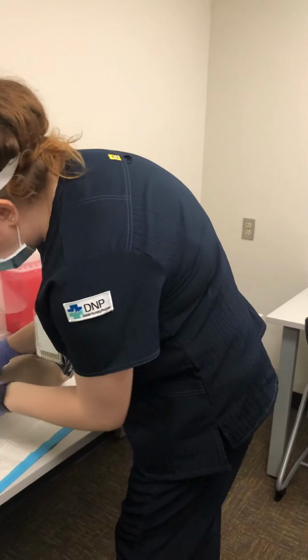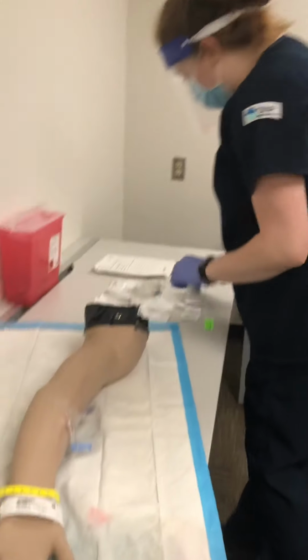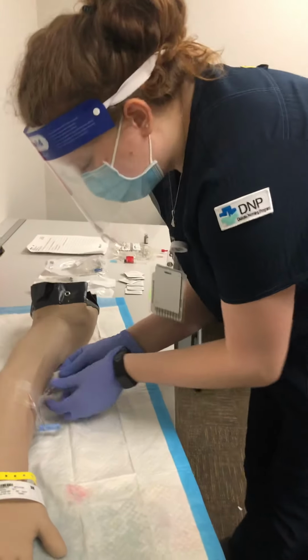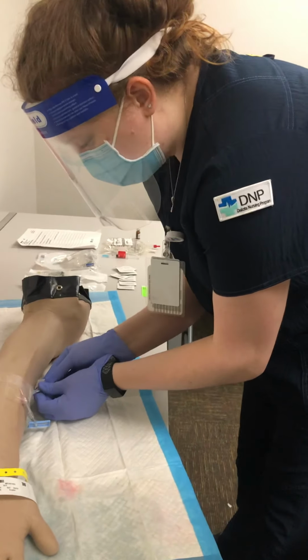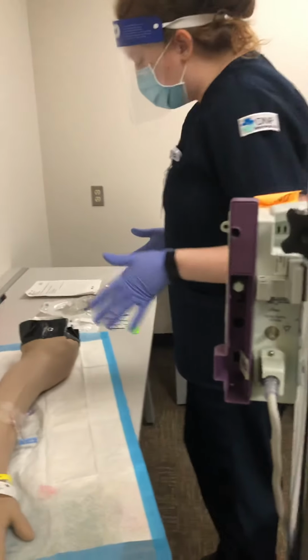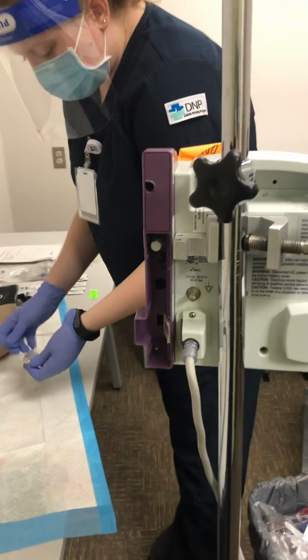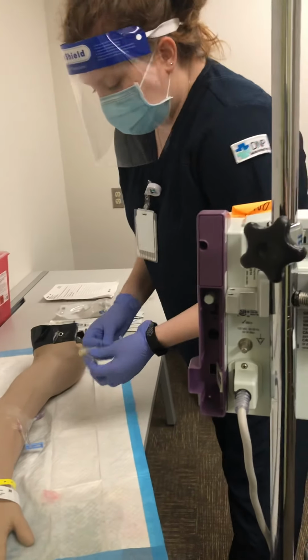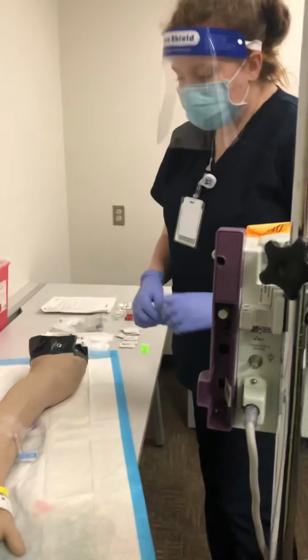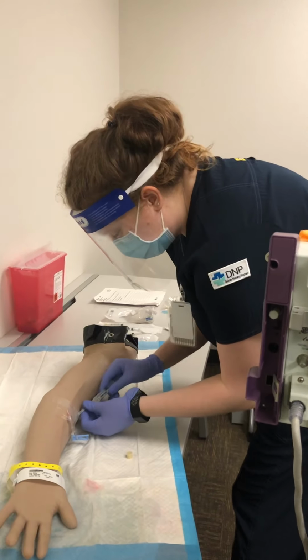is I'm going to inspect the IV site. I'm looking to see if anything seems abnormal or wrong with that. So the first thing we need to do is clean the port for 30 seconds. Let it dry. Again, for demo purposes, we're not going that long. So I'm going to be aspirating for blood. We're going to be aspirating for blood and then flushing this to make sure the line is patent.